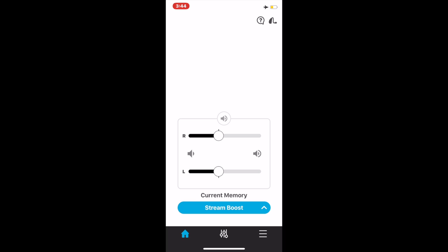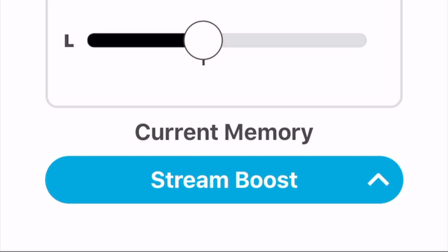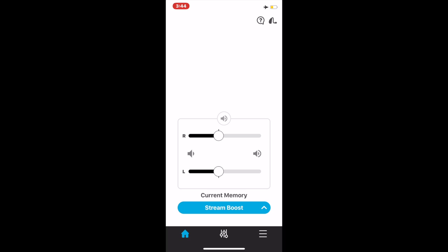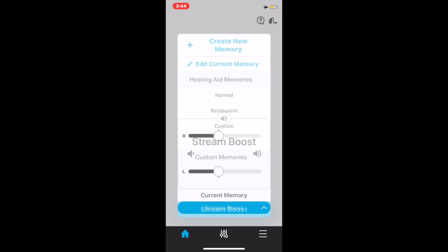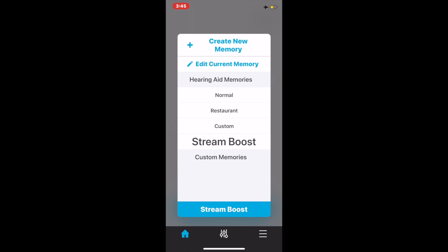At the very bottom, you will see a blue area. That is the current memory. Right now, the hearing aids are on what is called a stream boost because I am streaming through the hearing aids. By pressing that arrow, it will give me the options of my different memories.